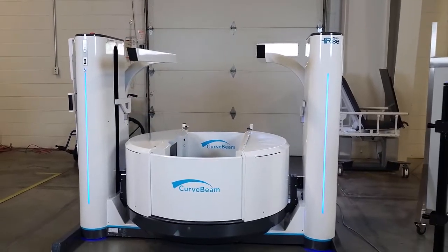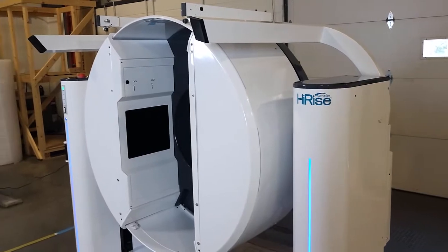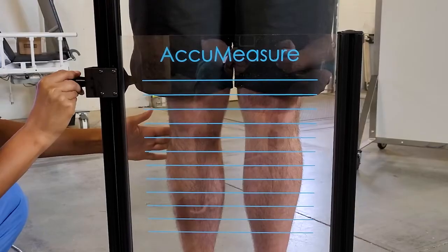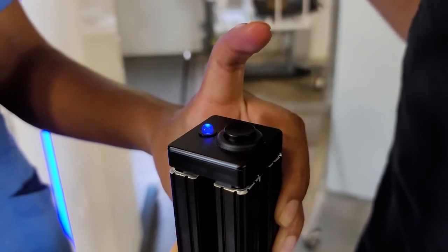The HiRISE is a multifunctional, weight-bearing CT system that can scan up to the hip and pelvis. The scan region for the pelvis, hip, and knees is set outside of the system using external markers, eliminating the need for a scout CT.